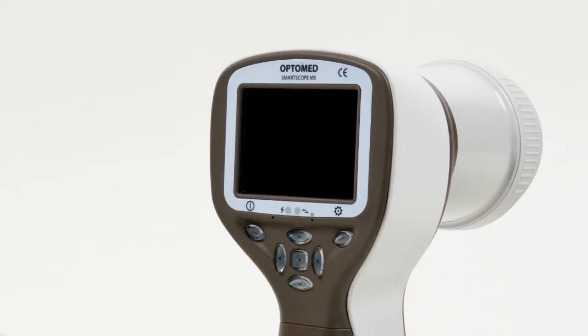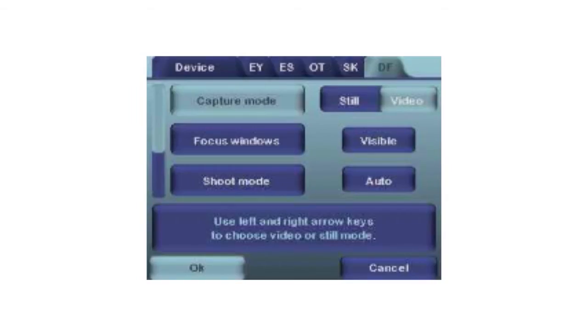Next, we will go through the steps for how to operate the camera. After powering on the device and attaching the optics module, select the preferred image capture mode — still or video. The selection is made from the optics-specific tab in the menu.